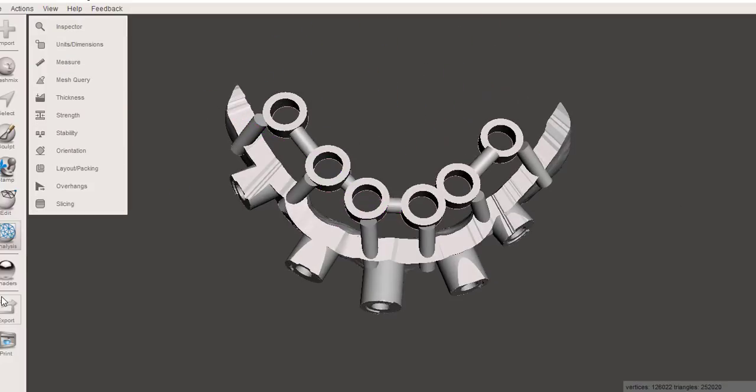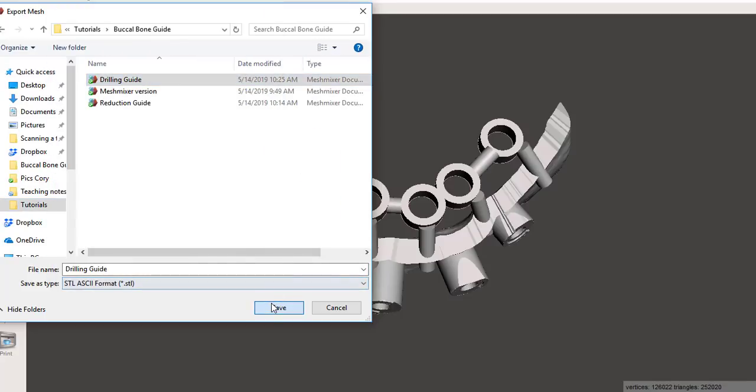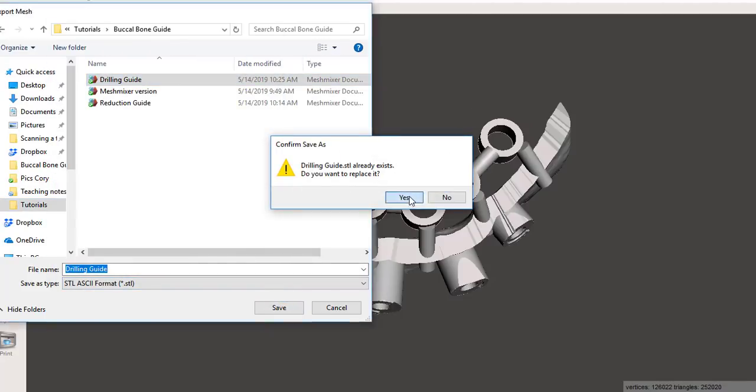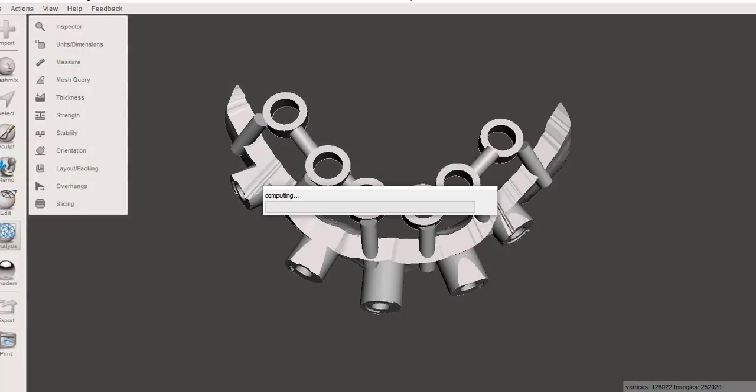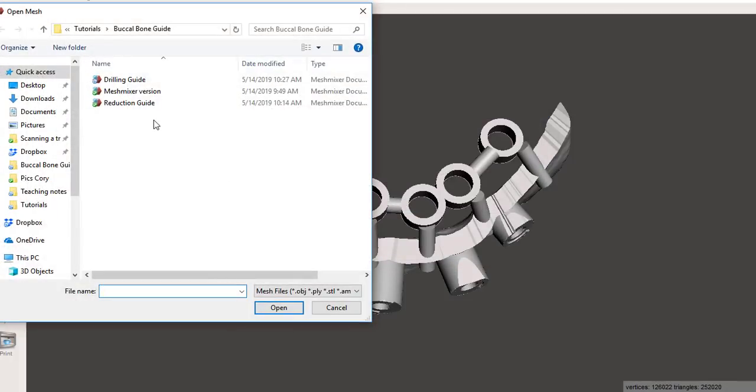We can just re-export this now as the drilling guide, and that will take the place of the original one that we had. And remember that we need to repair the original reduction guide as well. So let's pull it in here and repair it while we're at it.